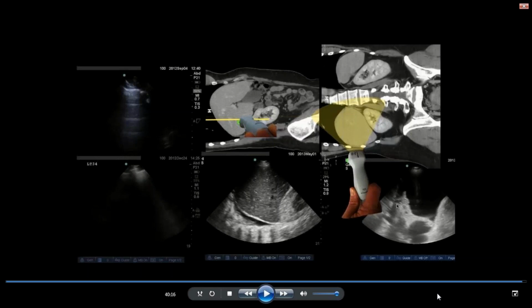A malignant mesothelioma will typically have a focal mass or tumor that you can see at the pleural line, and the resources I mentioned earlier are both excellent in terms of attaining a more in-depth understanding of pleural ultrasound, and there is a term that refers specifically to that other than lung ultrasound.